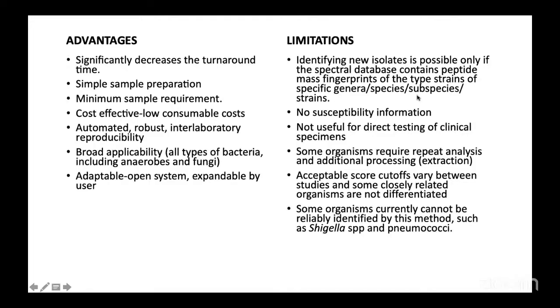What are the limitations? Identifying a new isolate is possible only if the company decides to include it in their database, whether it is Vitek or MALDI. I already told you that there are certain organisms which cannot be identified. Shigella is one, pneumococci is another.